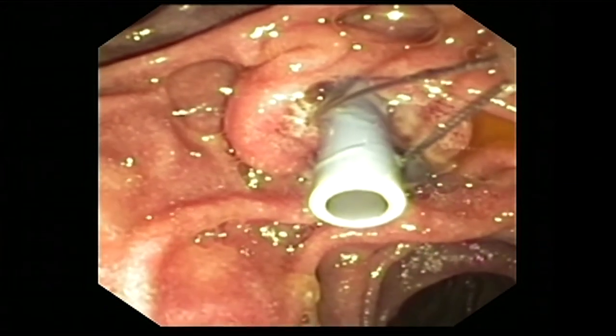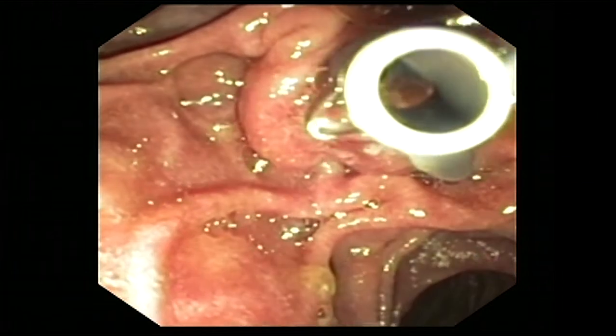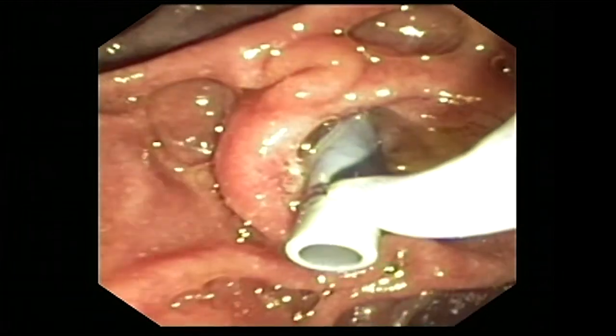So we've now captured the plastic stent, which we will now remove. You can see a kind of papillotomy has already been performed.